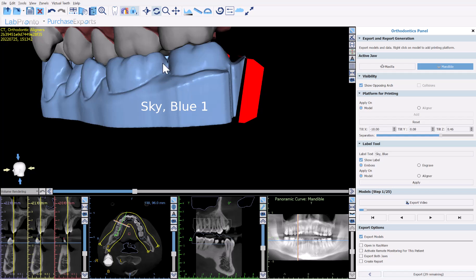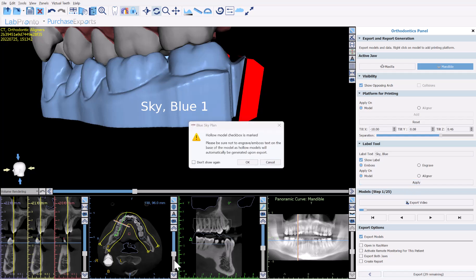By default, the number appears on the next row below the text. If you prefer them on the same row, click one line and click OK. Once text is positioned and sized correctly, select either model or aligner and click apply. A message will appear warning that text should not be on the bottom of hollow models, since embossing or engraving onto the bottom of a hollow model won't work. Click don't show again and then OK.